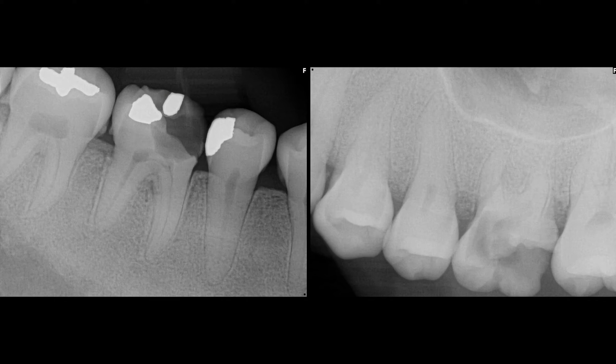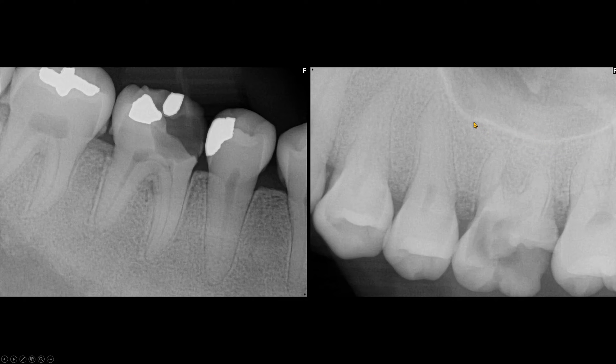In some patients with renal osteodystrophy, the sinus floor may be thin. In our patient, the sinus floor is well corticated.